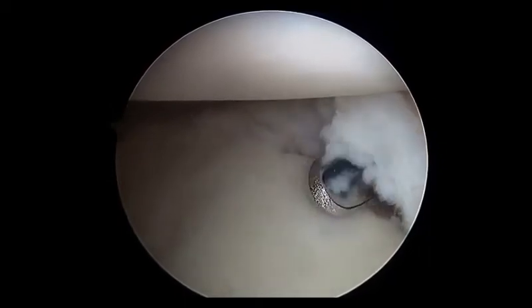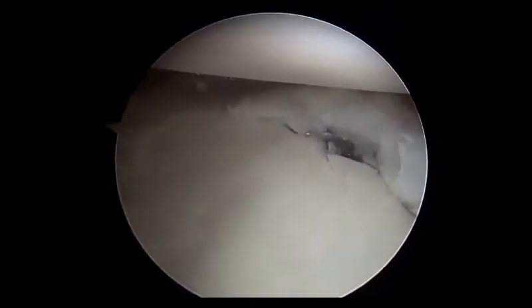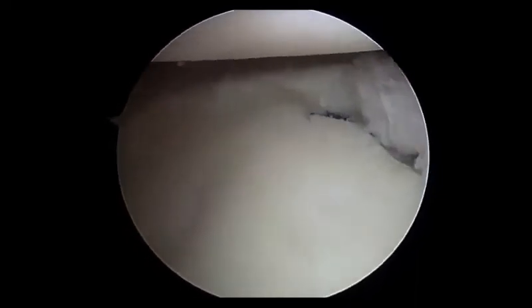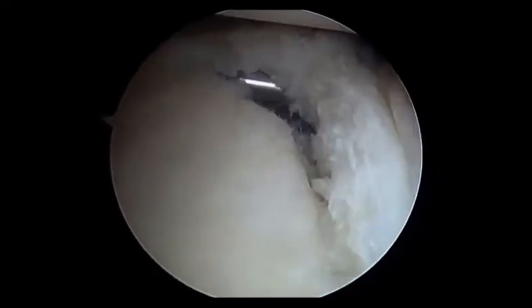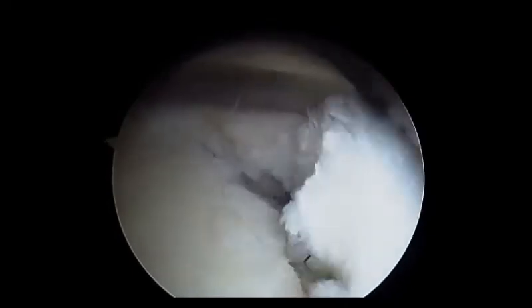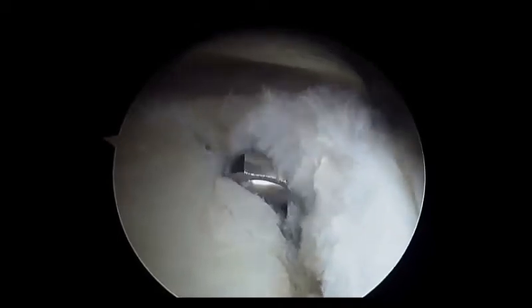A shaver or a switching stick can then be utilized to access the glenoid rim and bony margin deep to the labrum. Adequate preparation of the glenoid rim and labral tissue can then be performed without significant iatrogenic injury to the cartilage and soft tissue.